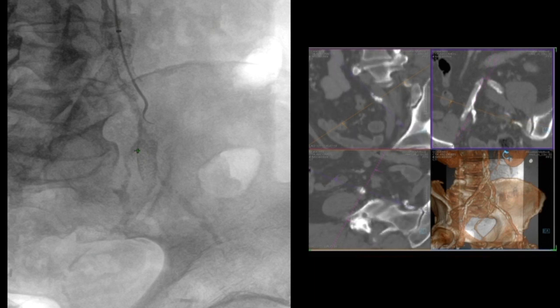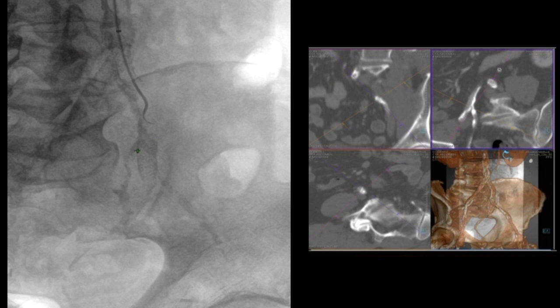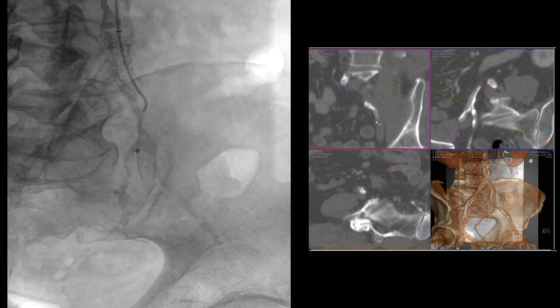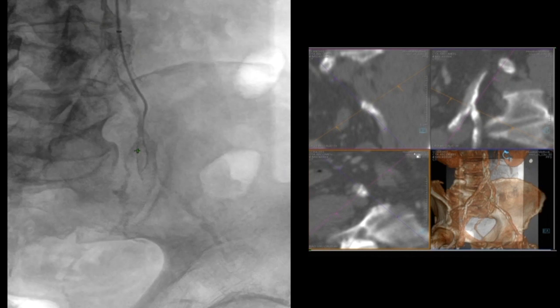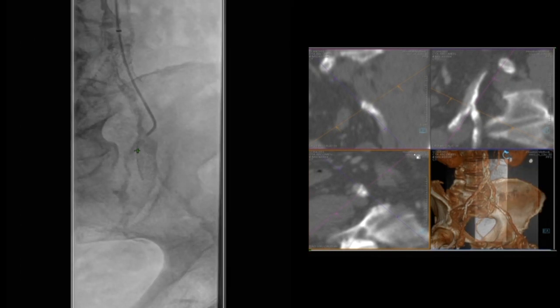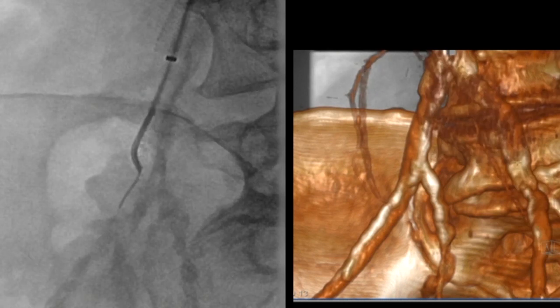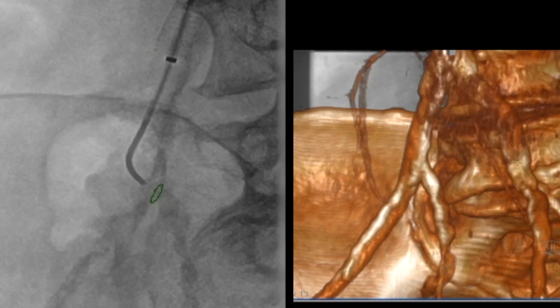We initially approached him having been somewhat pessimistic about our ability to revascularize the internal iliac because of severe calcification, and we initially approached him from the arm. You can see we tried first down the left side and you can see the calcification in the internal iliac. We were completely unsuccessful in trying to cross the left side, largely because it was covered with a bare metal stent.